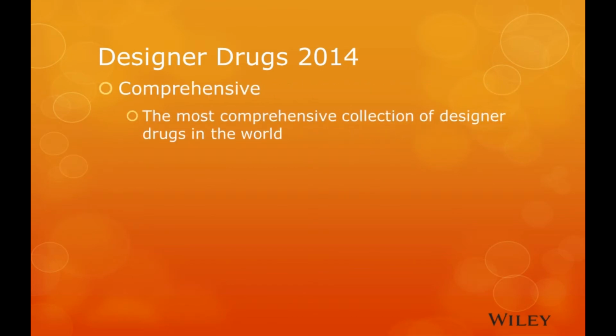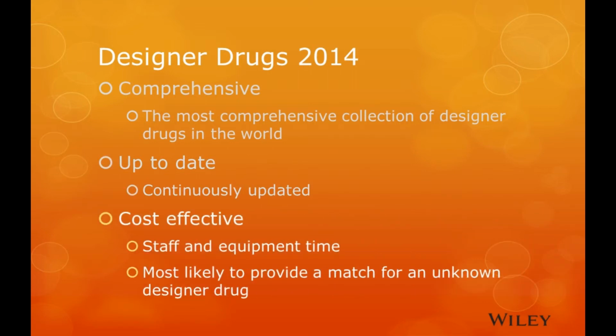So, in closing, Designer Drugs is comprehensive, it's up to date, and it saves your staff time.